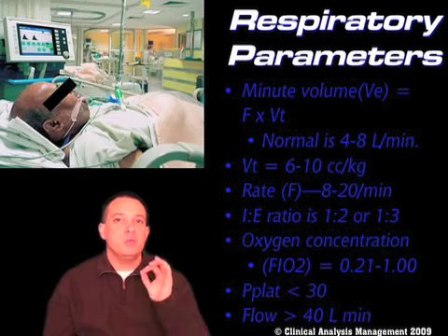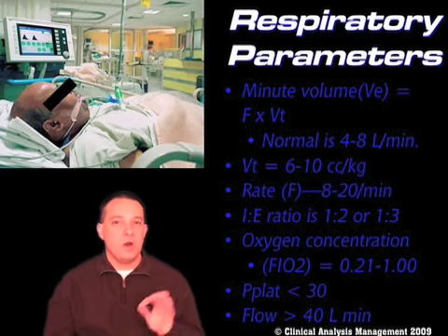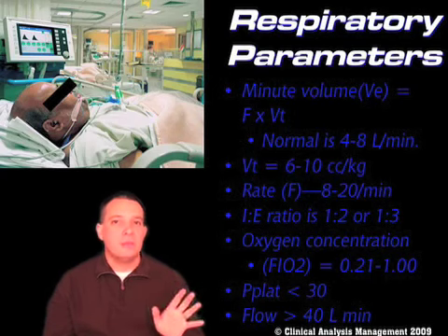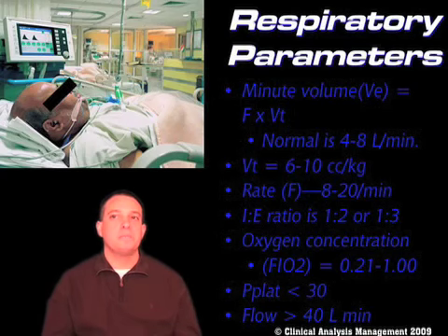For those patients, you definitely want to make sure that if they're not paralyzed, if they're being allowed to breathe on their own, that you have enough flow for them to breathe successfully. What that usually means is that your IE ratio is going to become like 1 to 5, 1 to 6 instead of 1 to 2, 1 to 3. Who cares about that? If your patient is being allowed to breathe, the flow being adequate is much more important than the IE ratio being nice and pretty.